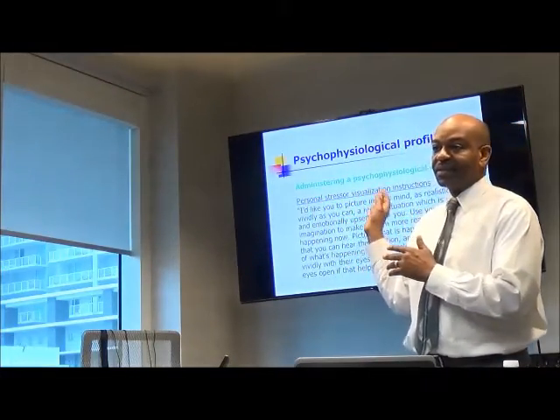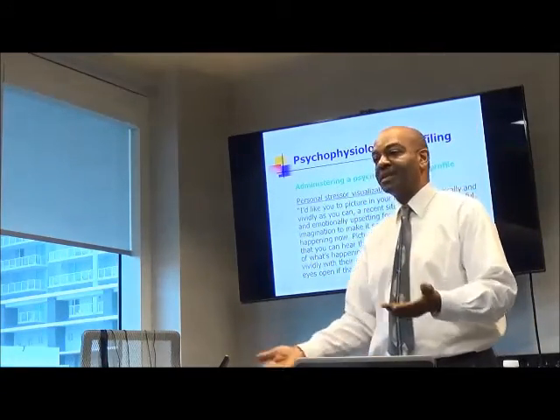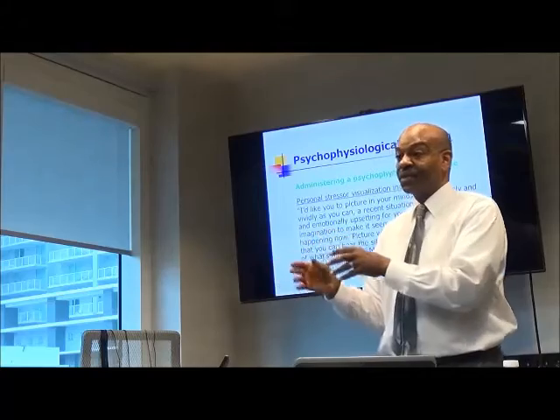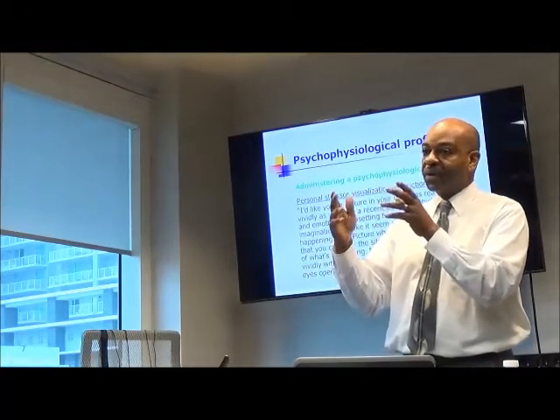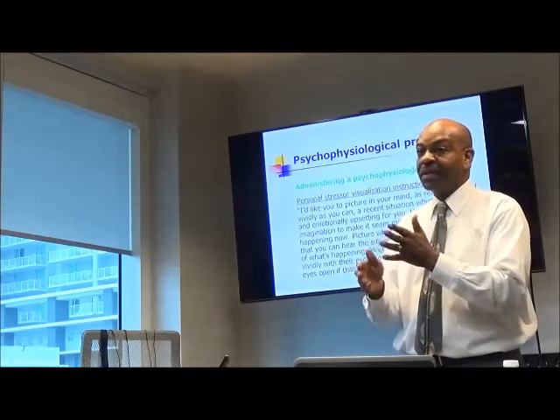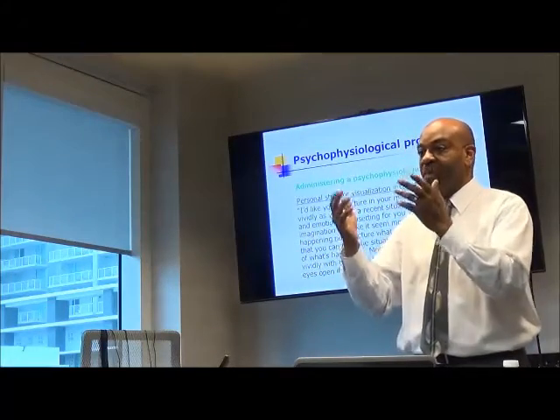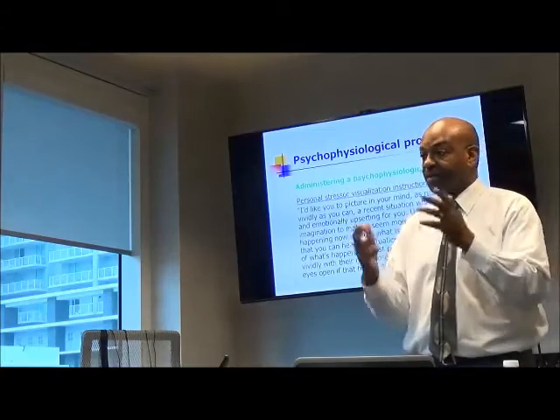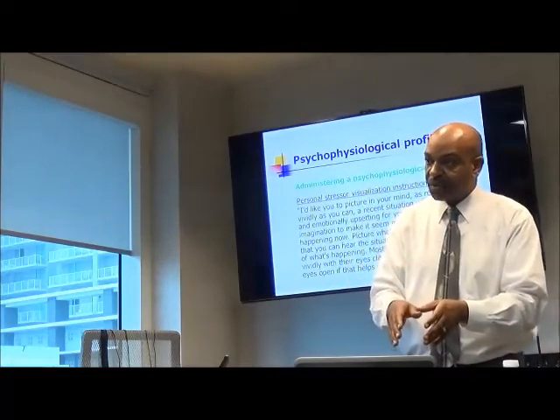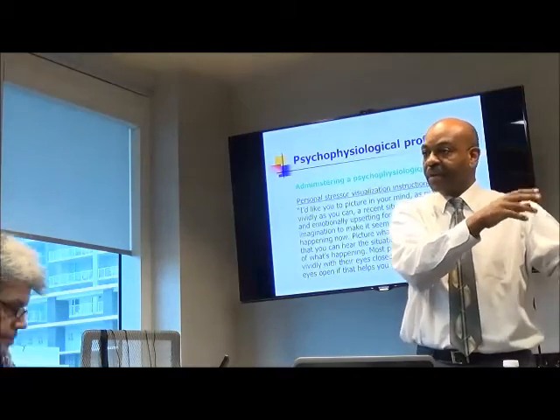Many times you see things that are not what you would expect. So just sort of a standard thing that you would expect is baseline, the readings are at least more normal. During the stressor, they go to what would look like a stress response. And it doesn't have to be for each modality, but for at least some of the modalities or one of the modalities, you would see this response, whether it's increased muscle tension or increased skin conductance, something like that. And then during the recovery, it either recovers back to baseline or it doesn't. And you see that pattern in the other stressors as well.